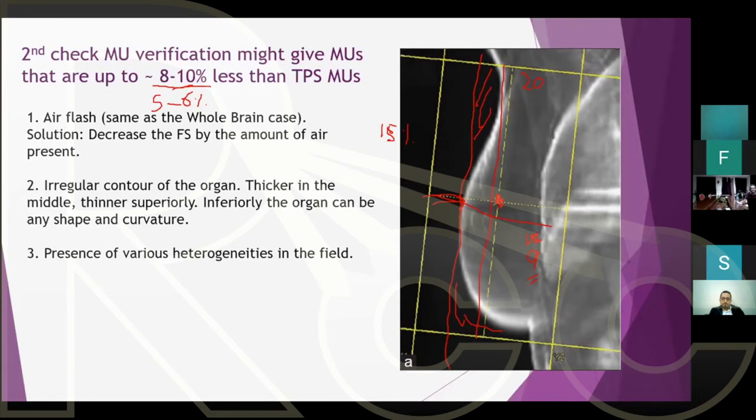Now, in the breast scenario, it's highly unlikely you will have 1% agreement. Well, you will probably have at best an agreement of 3%. Meaning, anything below 5% I will consider good for breast, because remember, the planning system knows the shape of the breast, it's thin from here, and then it's very thick from here. So there's a lot of tissue here contributing to scatter.